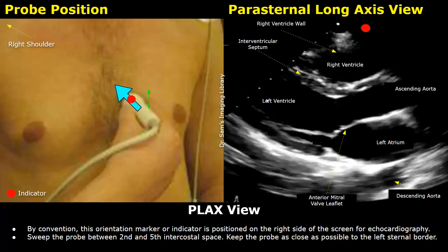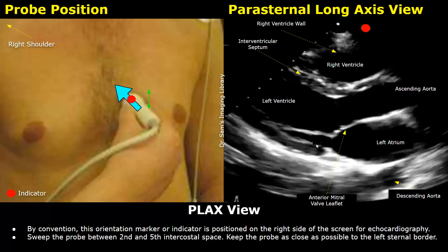The left ventricle is connected to the ascending aorta — this tubular area. The aortic valve is also present here but is not visible in this image because the valve is open. The posterior-most chamber is the left atrium, and the valve between the left atrium and left ventricle is the mitral valve. You can also see the anterior mitral valve leaflet. These linear echogenic structures are the papillary muscles, and this hypoechoic area posterior to the left atrium is the descending thoracic aorta.